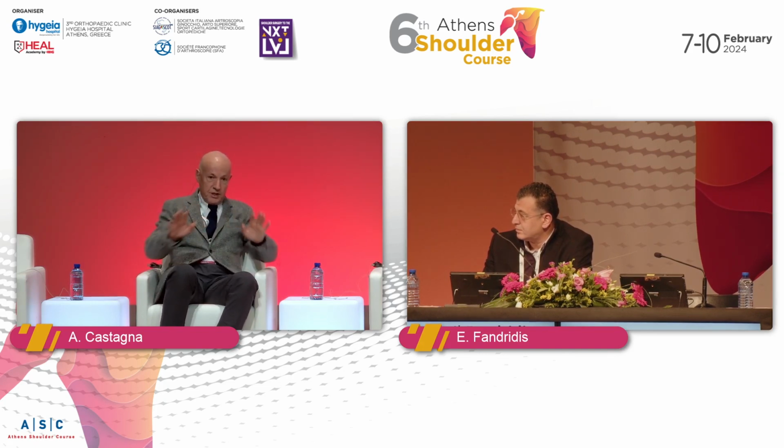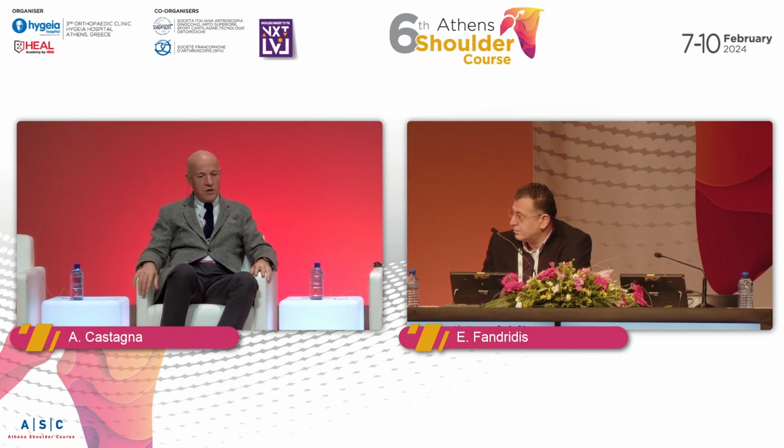The position of the scapula, Offer mentioned this. This is so important that we do not consider the mobility of the system, that is not only the glenohumeral joint with the fixed scapula, it is a system that is moving. So the posture may be influencing this, or the remnant part of the cuff, or other things that we cannot completely know.